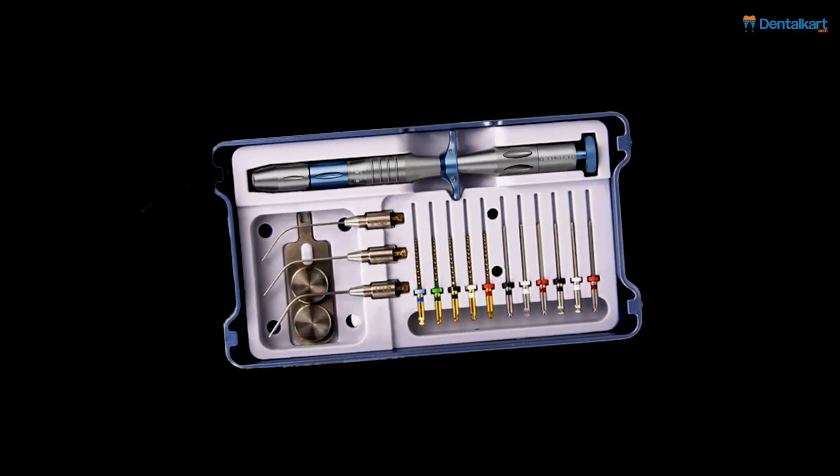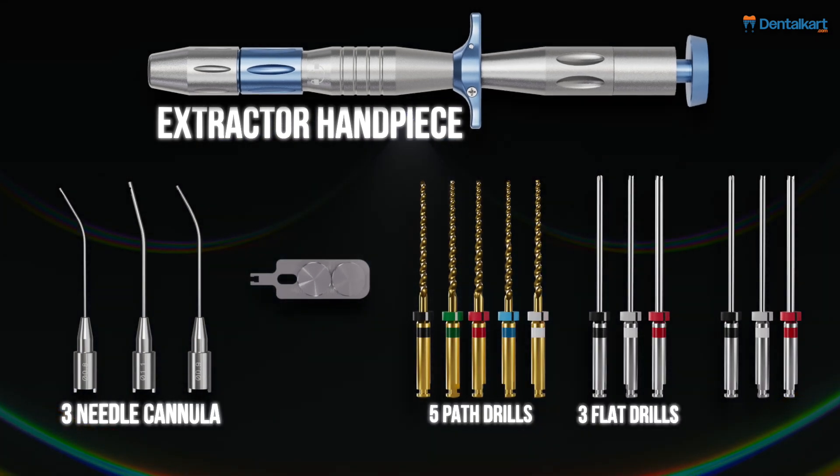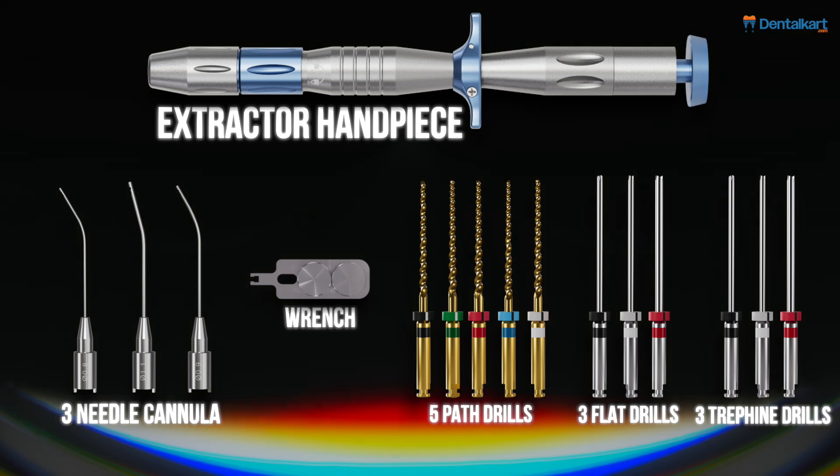The kit includes the following components: one extractor handpiece, three needle cannulas, five path drills, three flat drills, three trephine drills, and one wrench.